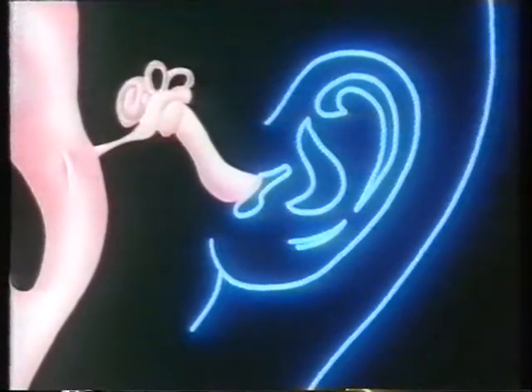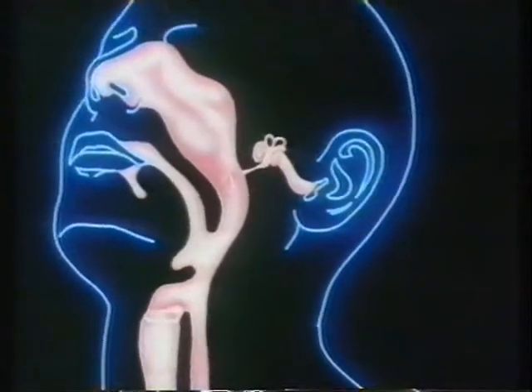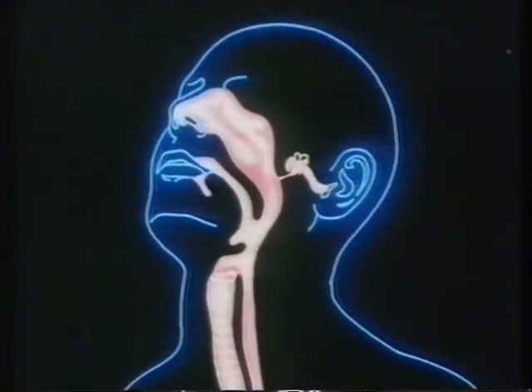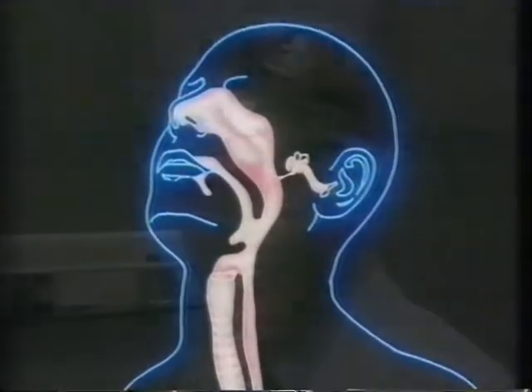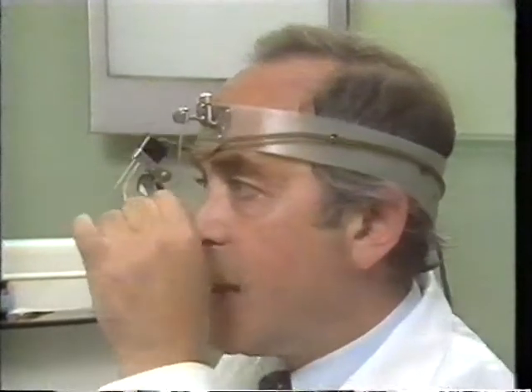Next, we must consider the ears. Apart from the more obvious reasons, any patient with vertigo or facial paralysis, for whatever apparent reason, must have the ears properly and urgently inspected. First, of course, the external ear is examined.